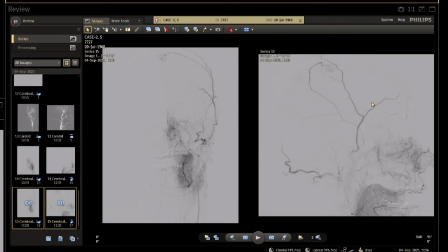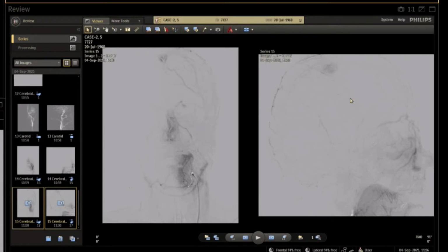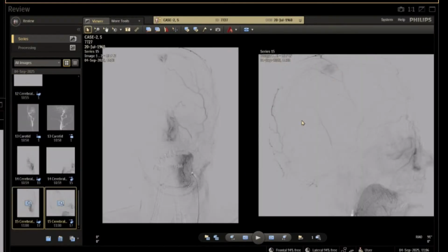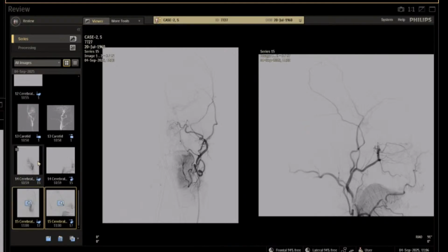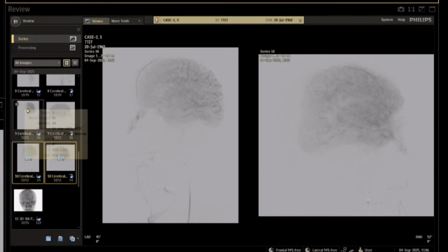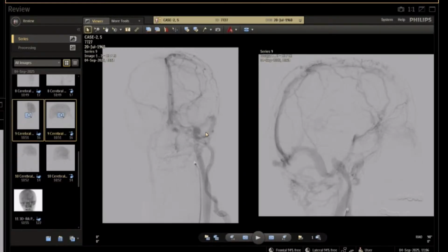Yes, I'm not sure. Many neurosurgeons will try to resect this meningioma. Yes, it's a very dangerous location. And okay, let's check the patency of the sagittal sinus. It's very important when you plan the meningioma treatment.